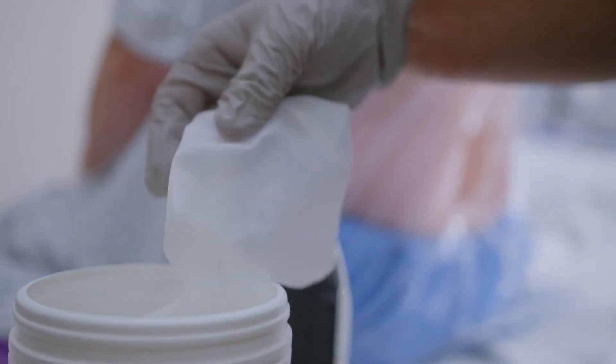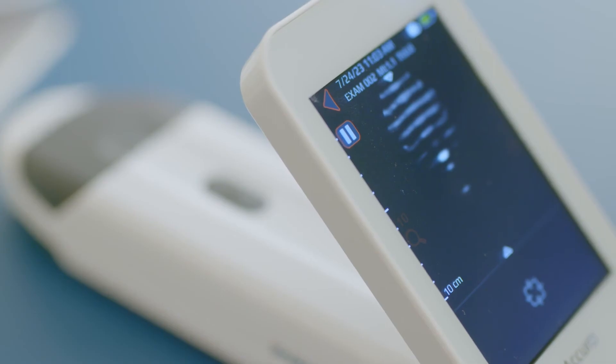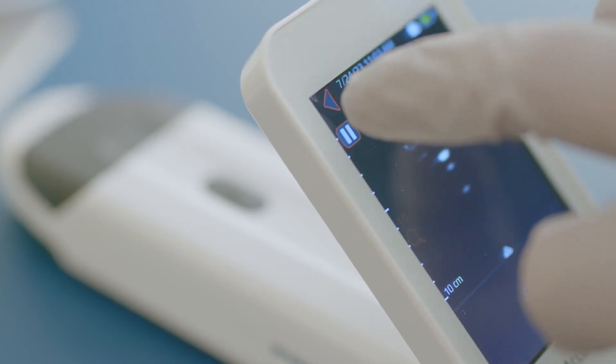Clean up. Discard the used locator. Wipe down the Acuro with a cleansing wipe. After each use, ensure the Acuro is in the sleep or off position to preserve battery.